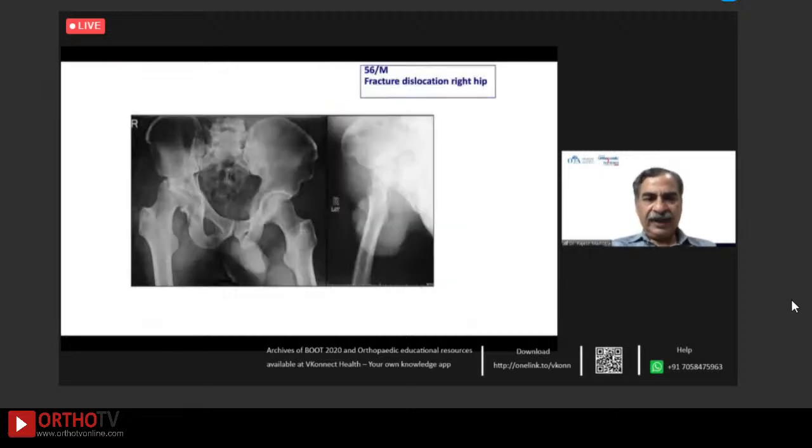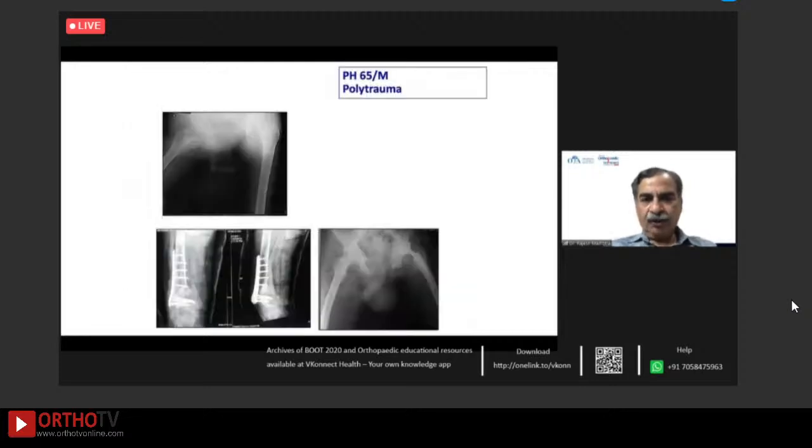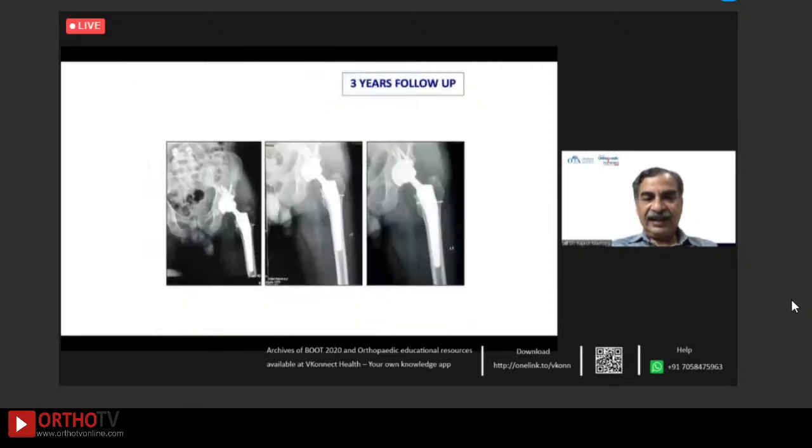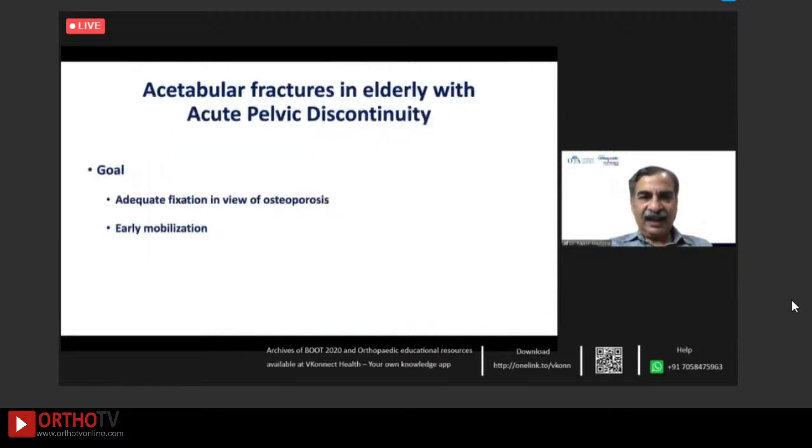The 56-year-old male with acute fracture dislocation right hip, and again modern porous cups could be used. Another case of polytrauma had a fracture of the distal femur on the same side, and the acetabular fracture on the opposite side. So we have published our results of acute total hip arthroplasty using modern porous cup. 18 patients, they used the Regenix cup, which has now been discontinued. 48 months follow-up showed excellent results.